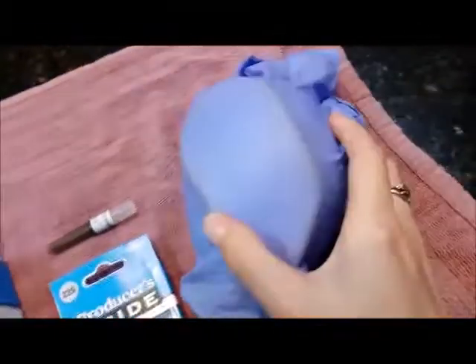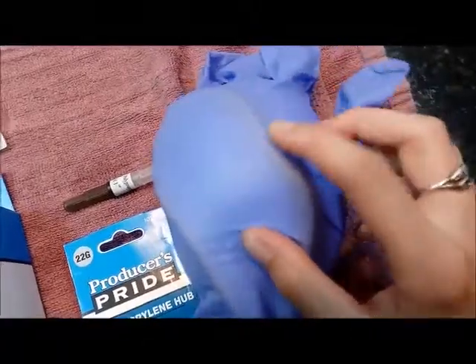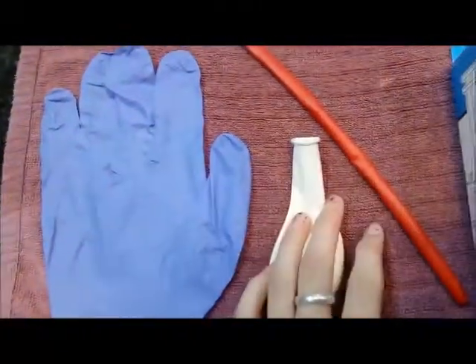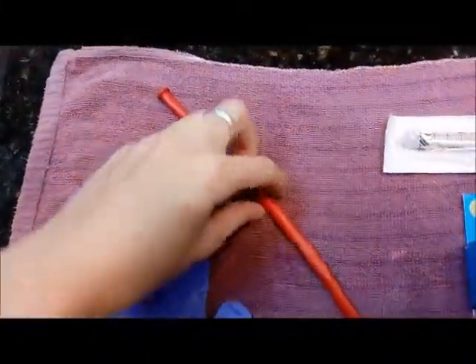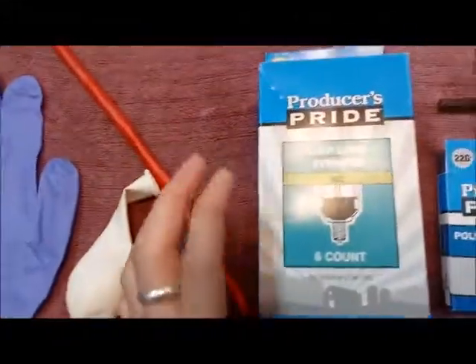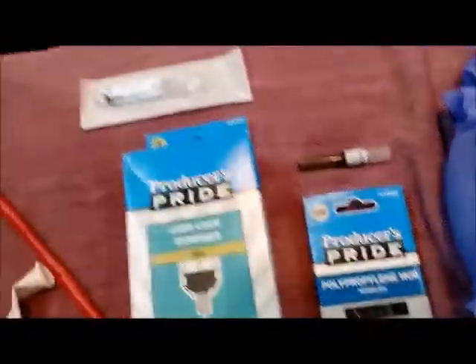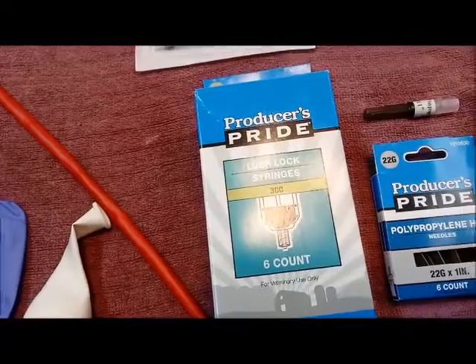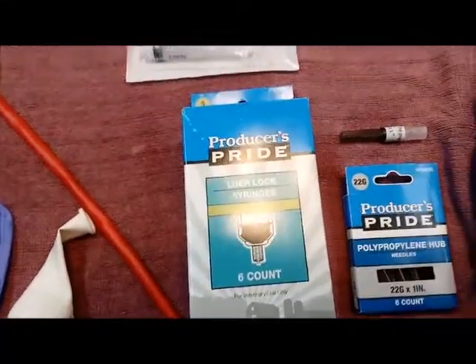Here I have created a little — I don't know what you'd call it — a little dummy test setup for a vein. What you'll need for that is a glove, a balloon, and then one of the long balloons that you'd use for balloon animals. You'll also need a pack of syringes and some needles. Tractor Supply sells them — this is where I got these — and you'll have to find out in your area where you can get needles. I'm pretty sure you can get these online as well.